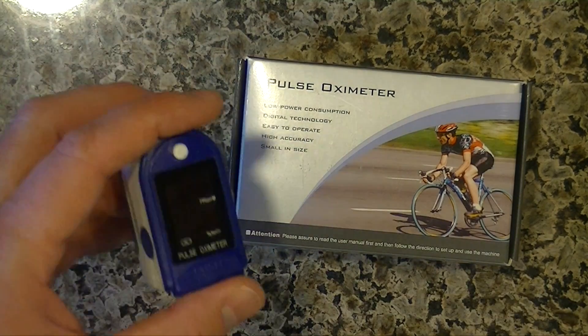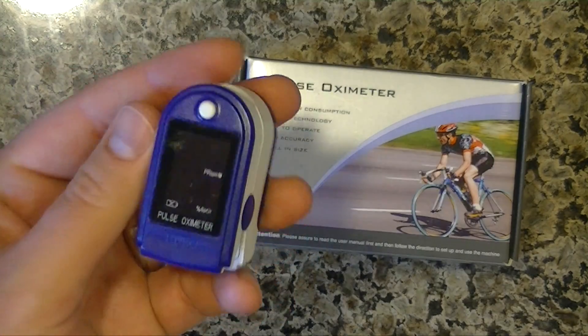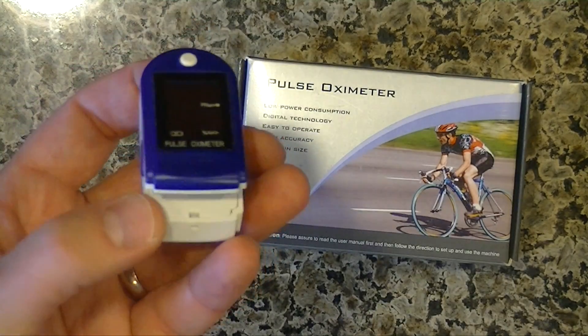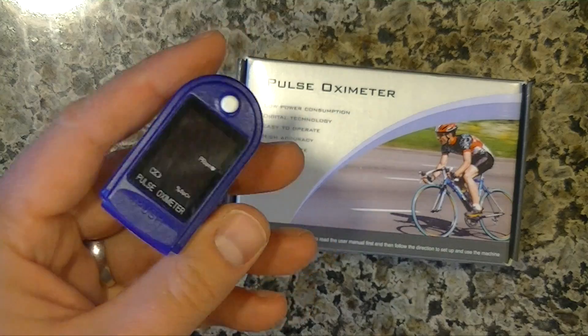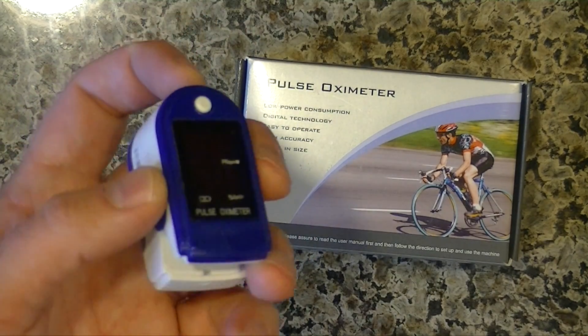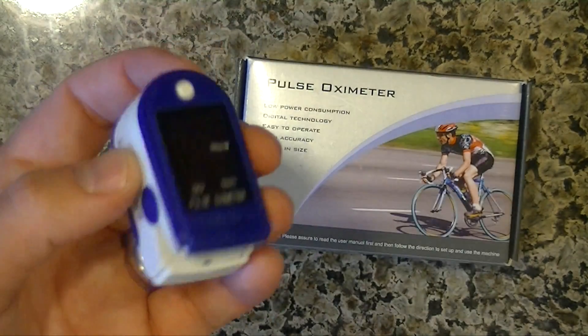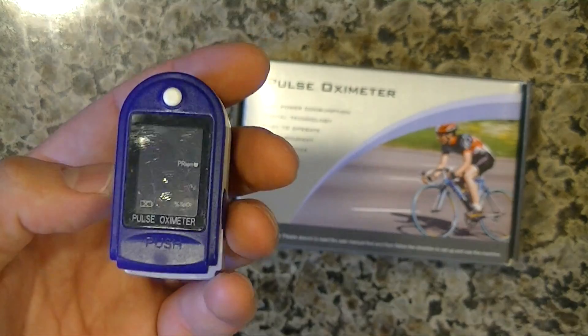I recently went to the doctor for just a checkup and they tested my blood oxygen. I happened to test mine the exact same day, and when I came home I tested it again, and it is very accurate — this device here compared to theirs.